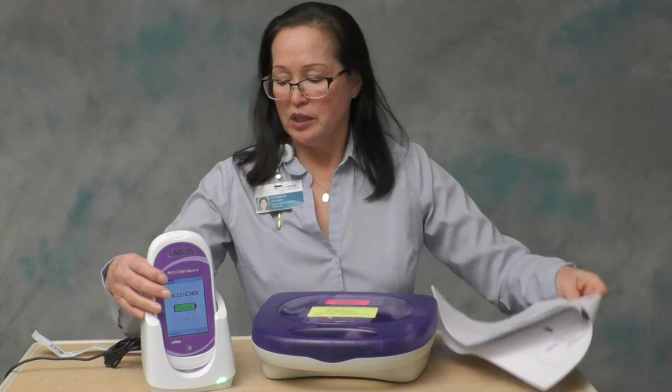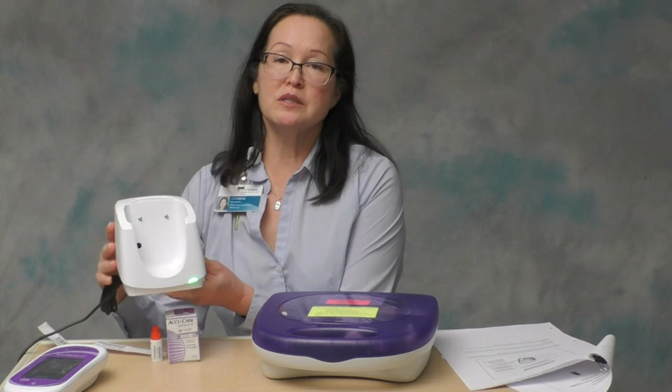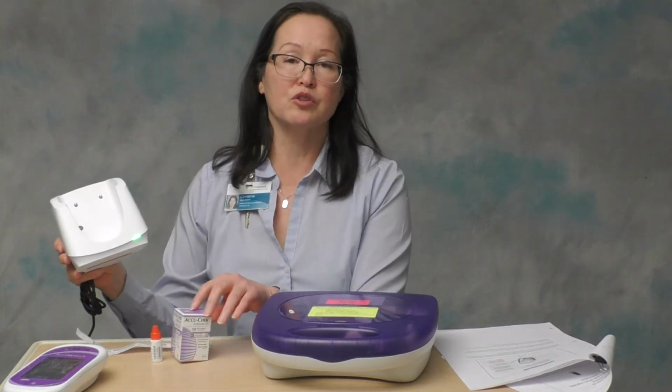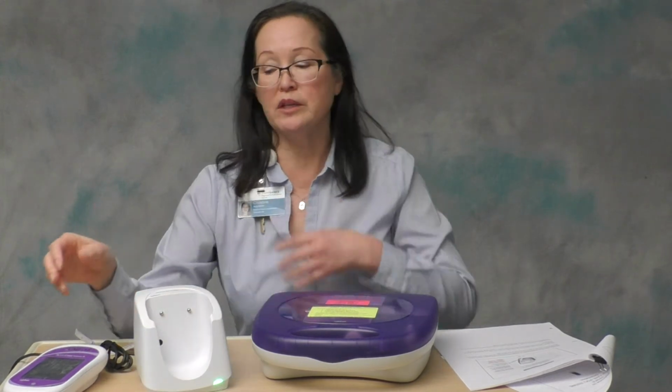The base unit has two functions. It recharges the meter's battery pack, so there'll be a power cord that plugs into an electrical outlet. In addition, it can transmit data through the network, so it will also have an Ethernet cord that will plug into an Ethernet port in the wall. You see the little metal battery contacts there. That's how it recharges. These go in and out. But every once in a while they can get pressed into the base. If that happens, give us a call because we can troubleshoot it and help pop them back out.